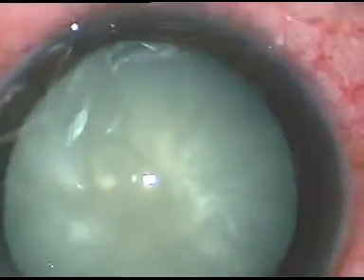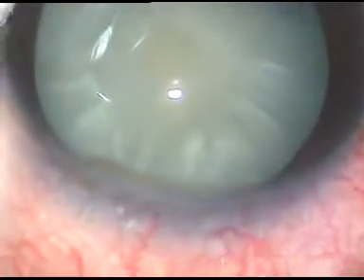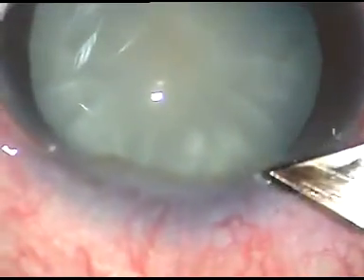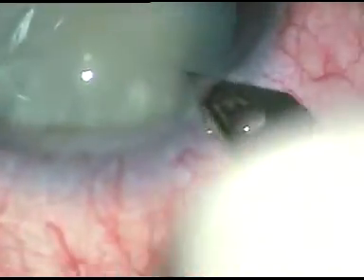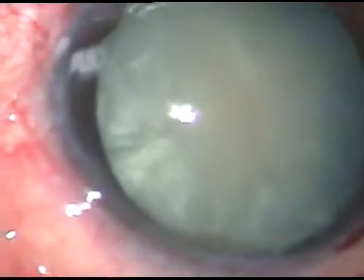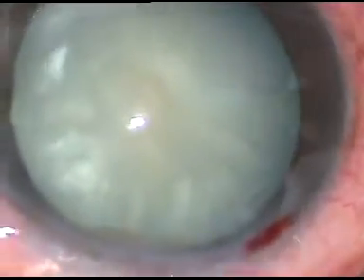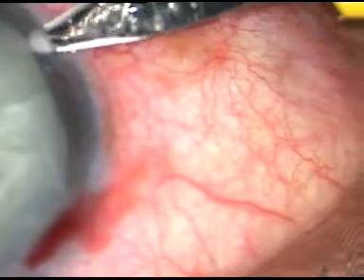Hello, dear colleagues. This is a mature cataract. A 2.8 millimeter main incision is made at 11 o'clock. A paracentesis incision is made at 8:30 o'clock.